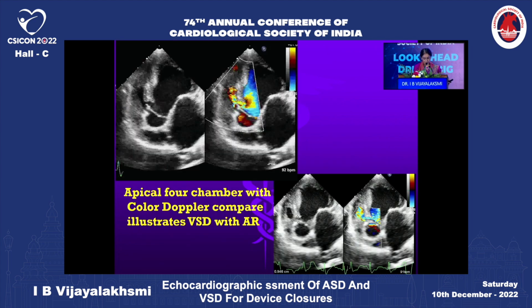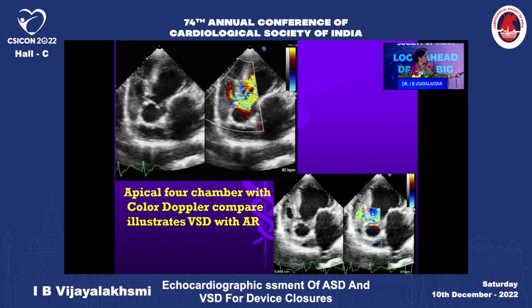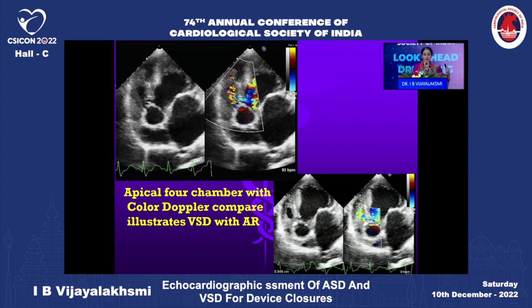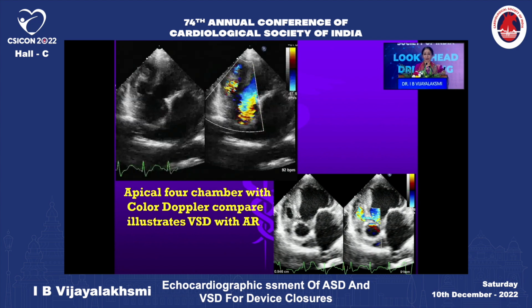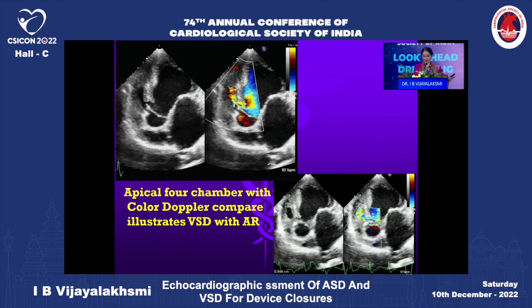This is a 52 year old person, and look at that. The VSD is very small and they did not close it. And ultimately, what has happened? Severe AR has occurred. So what could have been closed with a simple VSD device now needs aortic replacement with patch closure.